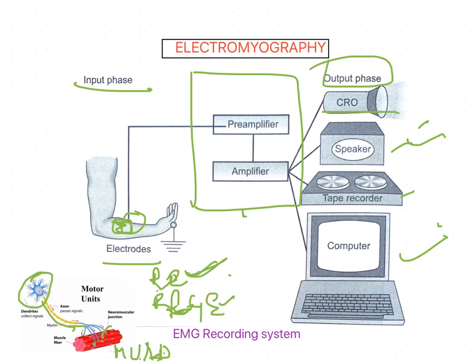So once this myoelectrical signal, which is produced as a result of muscle or nerve depolarization, is converted into an electrical potential, it is capable of being processed by the amplifier. It is the difference in the electrical potential between the two recording electrodes that is processed. The potential difference is measured in volts and the amplitude is usually measured in microvolts.